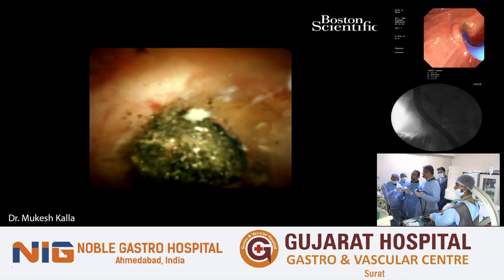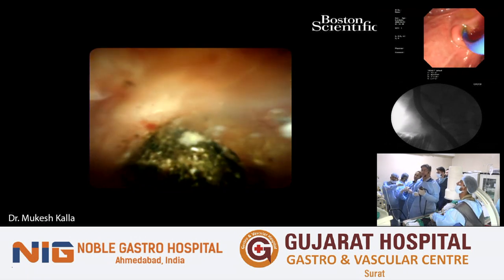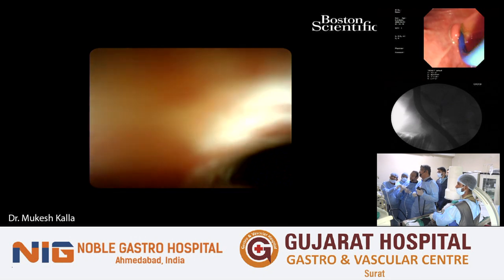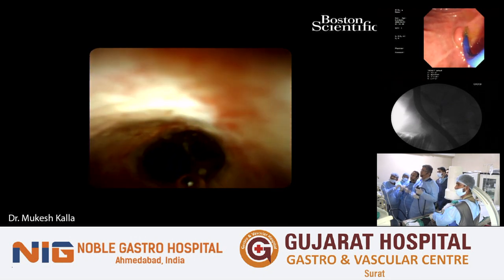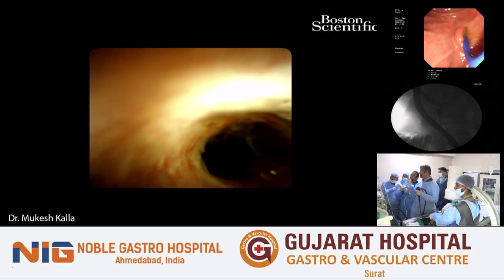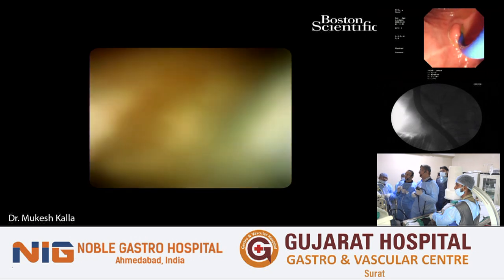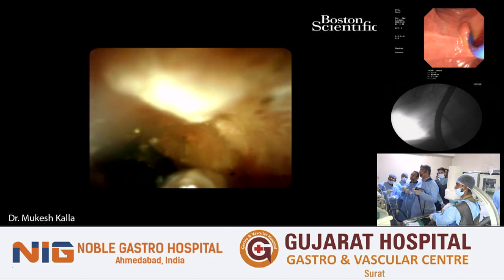So whatever we are seeing will be kind of a demo for the retrieval. Now I am again focusing. Now there is a small problem, which is a troubleshooting here. Somil has passed a spy basket inside. This basket was not going and it was getting stuck. So what I did, I went in and straightened the scope so that it doesn't get into the curve. It doesn't get engulfed in the curve.